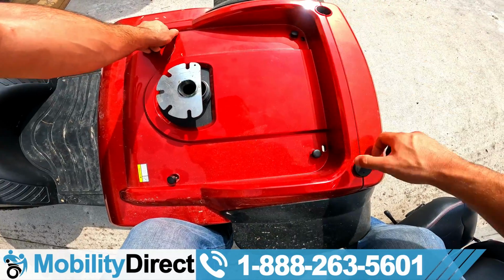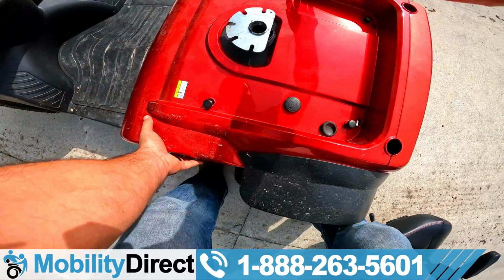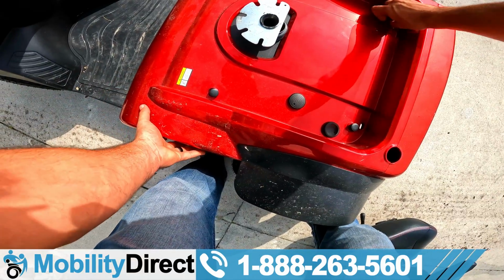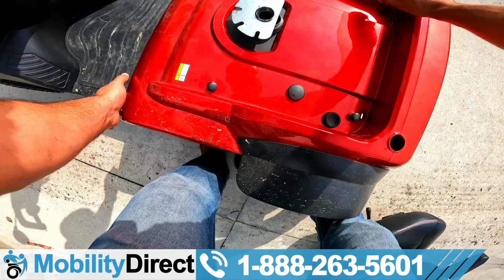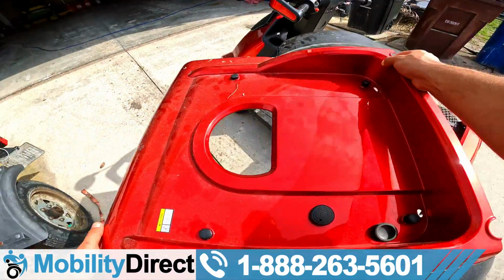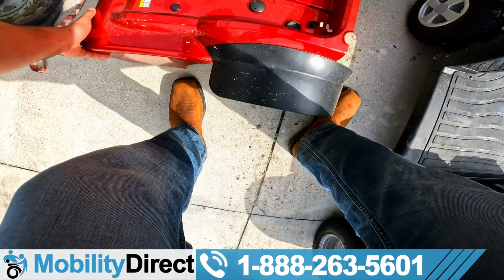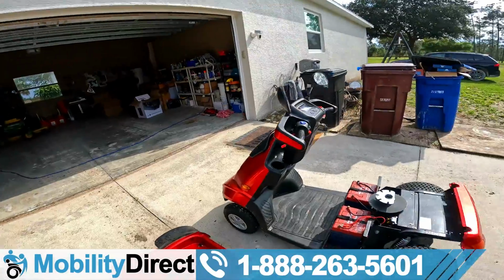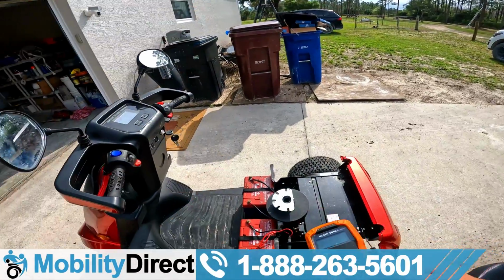I'm just going to take these rubber caps off because I know they always pop off whenever I'm removing things, and make sure they don't go anywhere because I don't want to lose them. They're just there for aesthetics, but I don't want to lose them. So I'm going to take the whole cover off now, put it to the side, grab my multimeter, and start looking at stuff here.